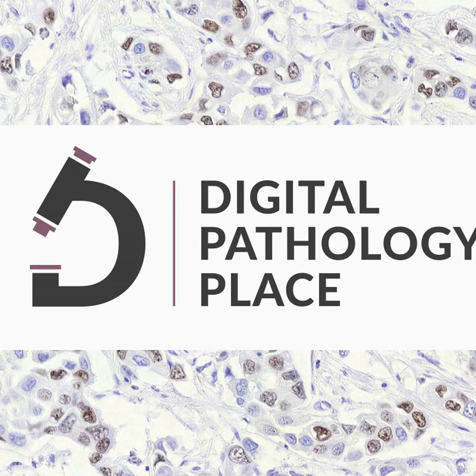One of the ideas that we had with Jared on how to make the most of the system being placed in Tanzania was that Jared would train artificial intelligence in the system. As you mentioned before, it's an augmented reality microscope: the system is placed into the microscope, and while the pathologist is looking through the eyepiece and sees the same optical plane of the tissue, they're also able to see augmented reality, like a digital overlay on top of the optical plane.